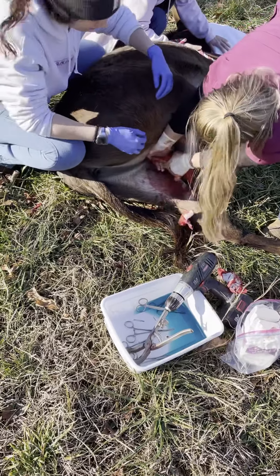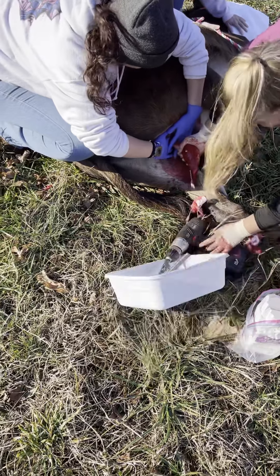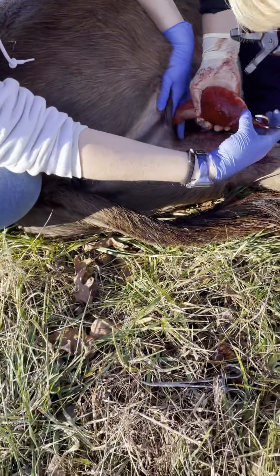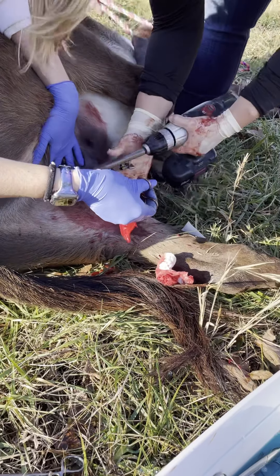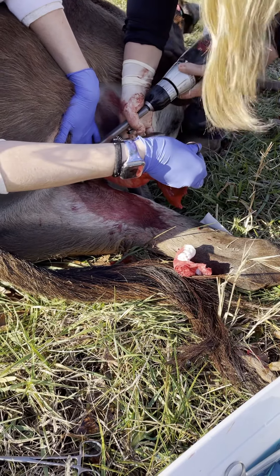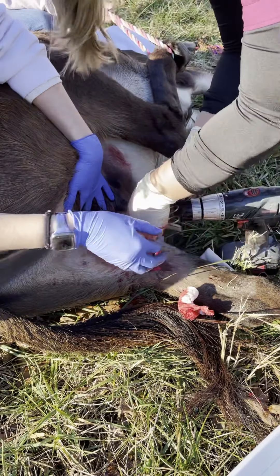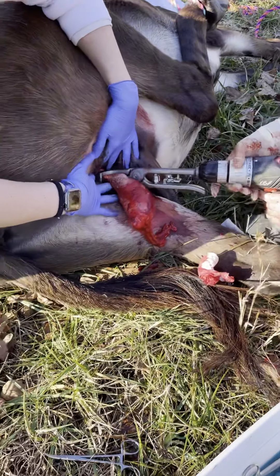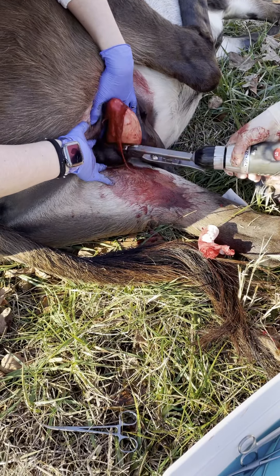Now you are going to do the same thing — just trail it. Pull, now. Go this way a little and push. Pull a little bit more. Pull — are you pulling? Okay, I'll go and clamp this. Twist. Alright, you ready? Got your fingies where they need to be. I lost some on my hold.